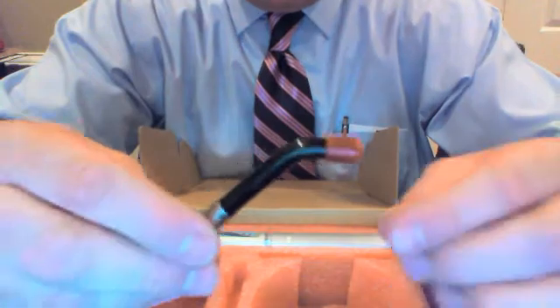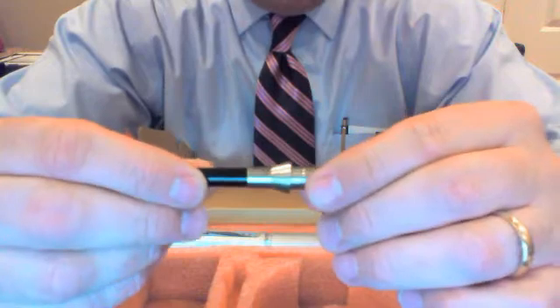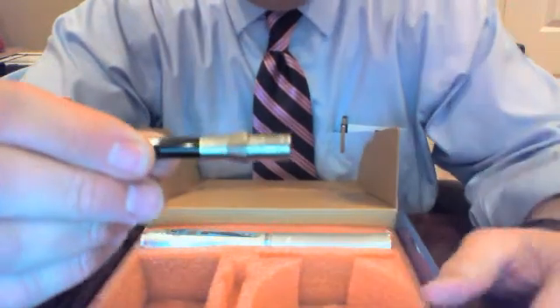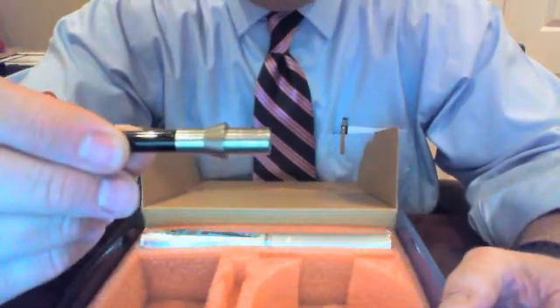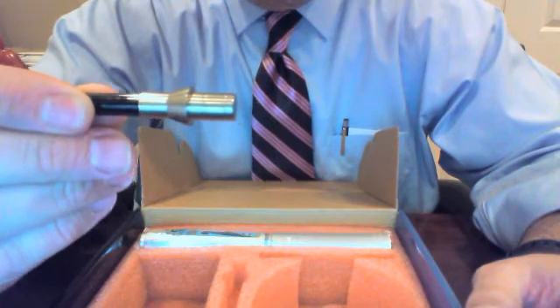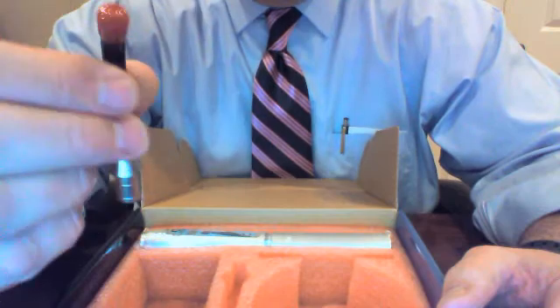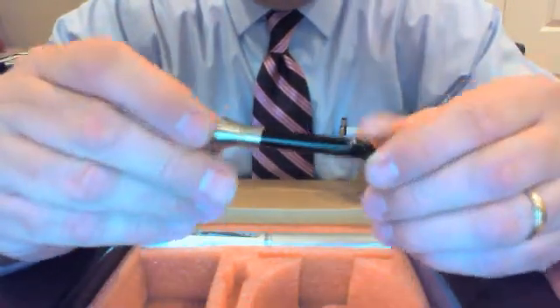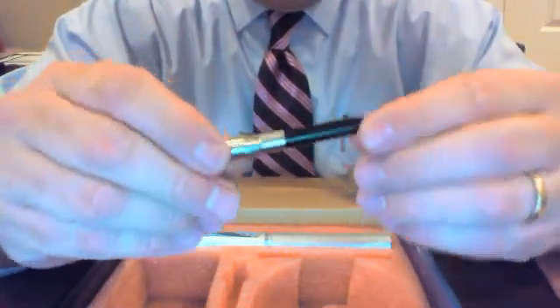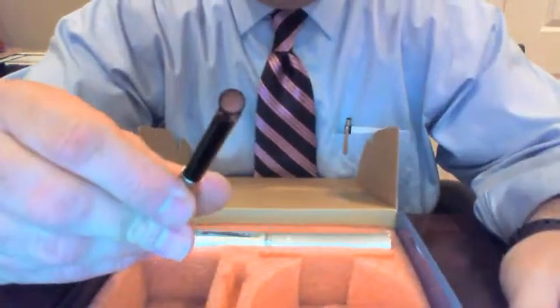Our light guide is a fiber light guide and it comes with a protective tip. You'll notice when you unpackage this, the machine tooling is very, very impressive, and it actually sucks down into the light. You'll be very impressed with the workmanship on this light guide, something we also sell replacements for. This is our light guide, and you can see the fiber tip.